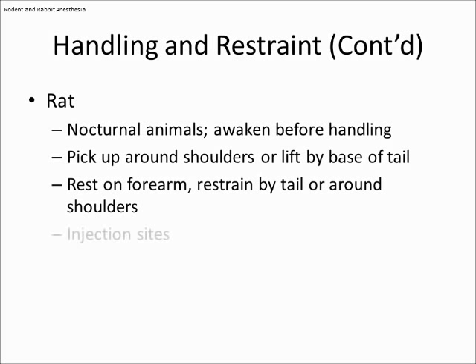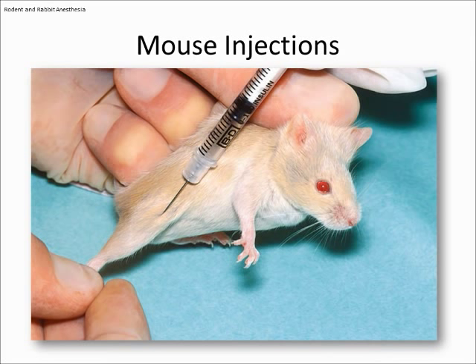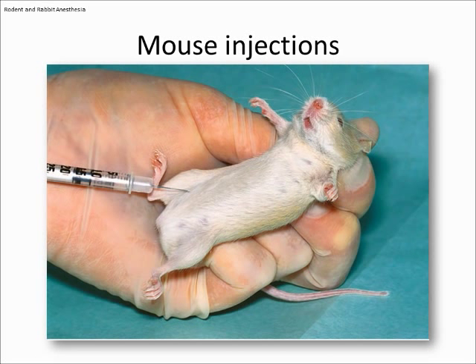Ah, look at this thing. Okay, so we have essentially a couple different injection sites, but the two most realistic. Intramuscular, and so you're going to use the femoris muscle. And then the second one here is, Danny, do you know what that would be? Looks like it's right on the thigh, isn't it? It's not. Nope. Wendy? Very good. IP, or intraperitoneal. P, peritoneal, the peritoneal cavity, the area that surrounds all of the abdominal organs.